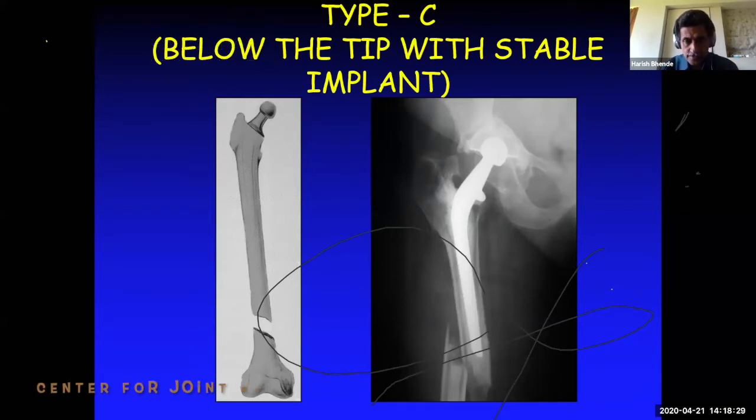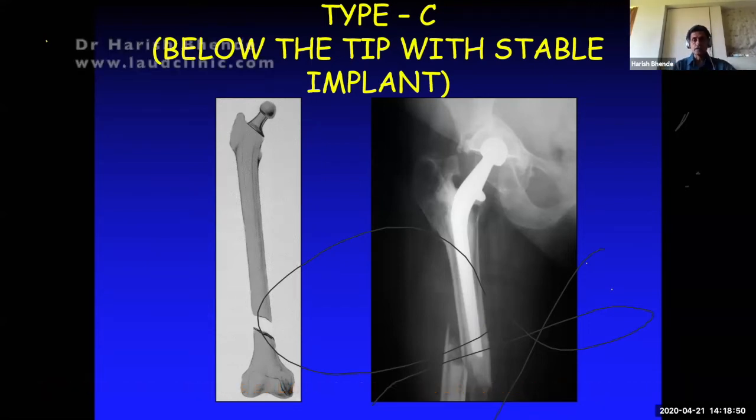It is very essential for a surgeon to realize that when you talk about these type C implant or type C fractures, the bone has got internal cement and internal metal. So the endosteal part of the healing may not happen as we normally expect it to happen. So in that scenario, you have to be very, very gentle and careful about how you dissect the bone.